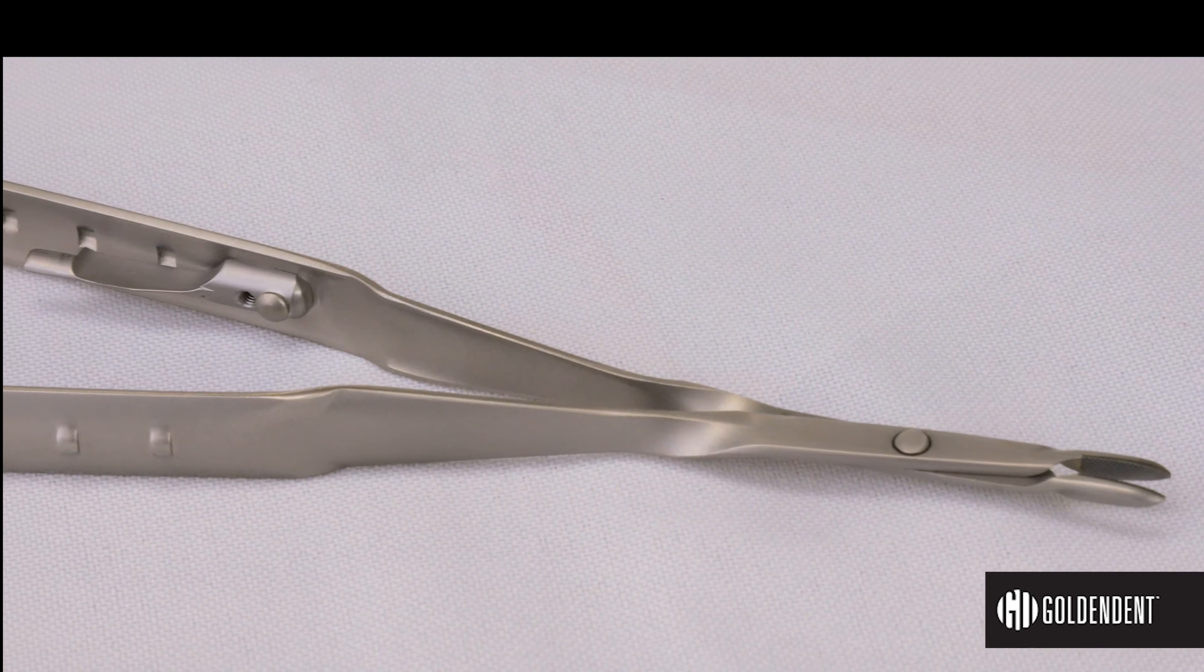Secondly, these needle holders only hold one size needle and over time it loses its shape and therefore its ability to hold a needle securely.